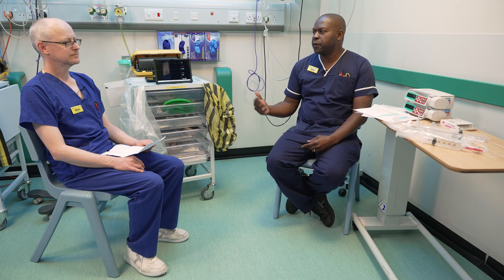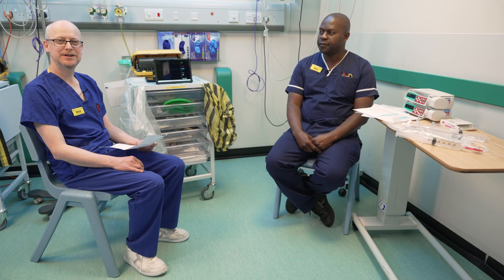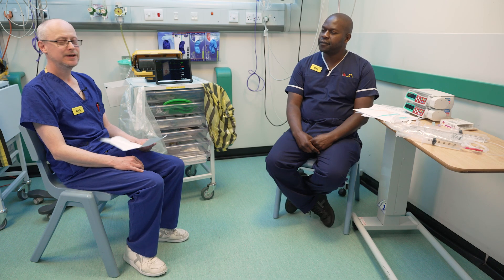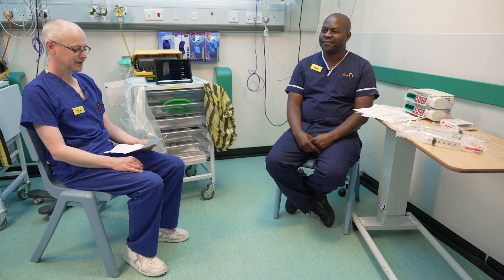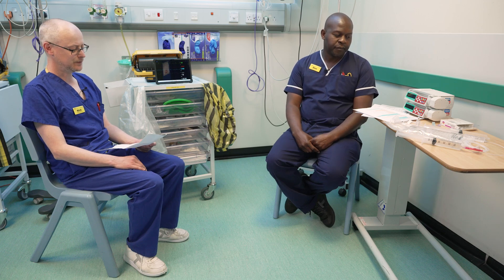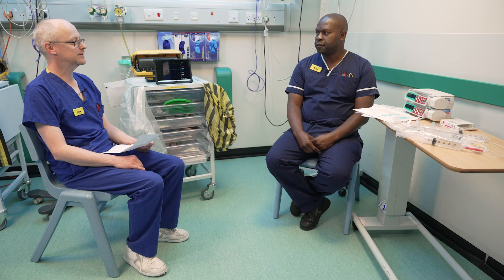I'll introduce you to my colleague. Hi there, my name's Nick. I'm a recovery nurse and I've been here for seven years. It's a great team here and I work with Dan. I'm going to ask a few questions. So we're going to talk about noradrenaline and why we would use it with certain critically ill patients.